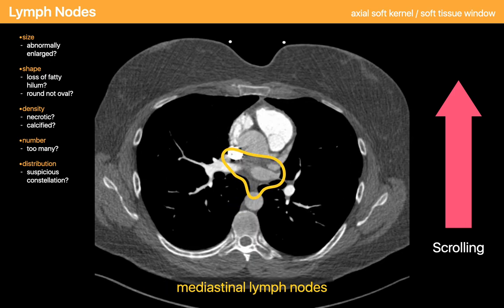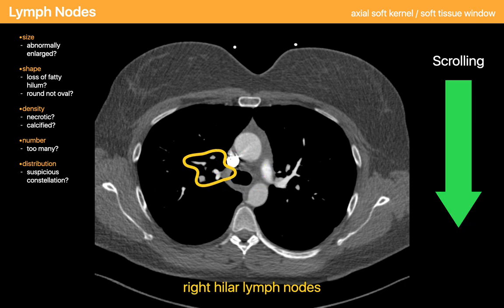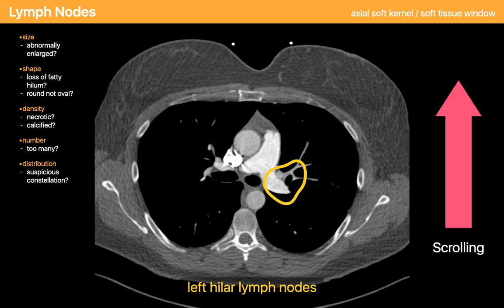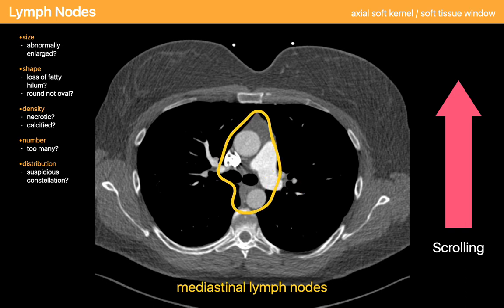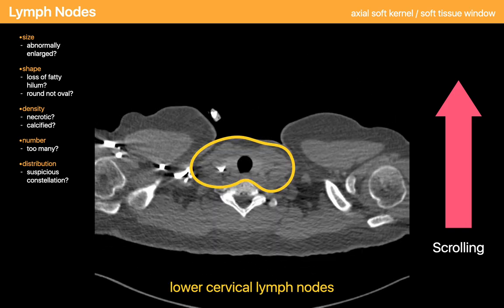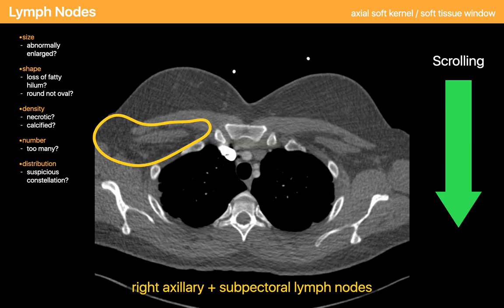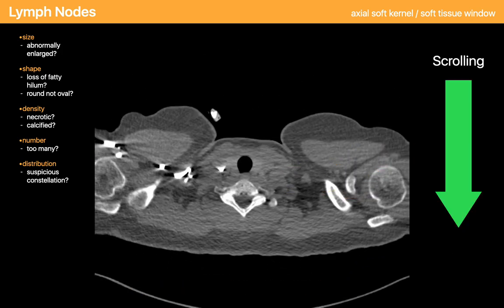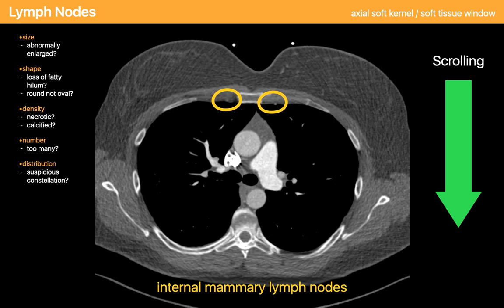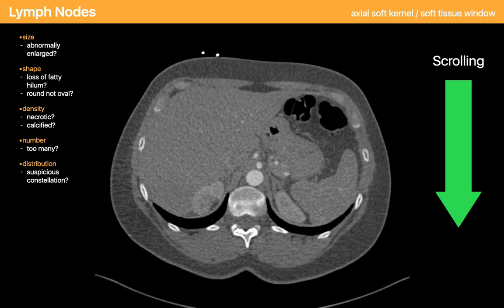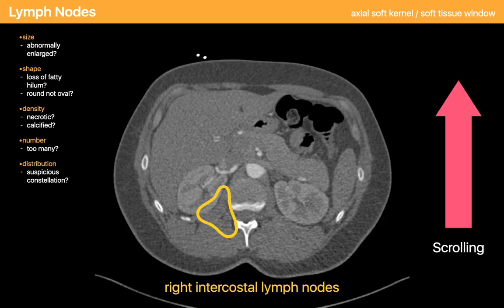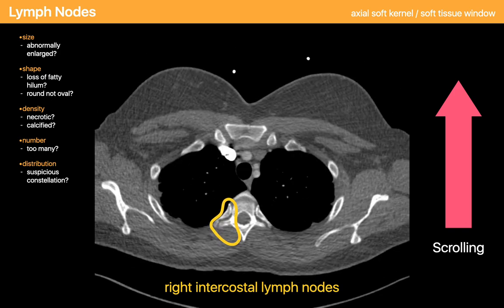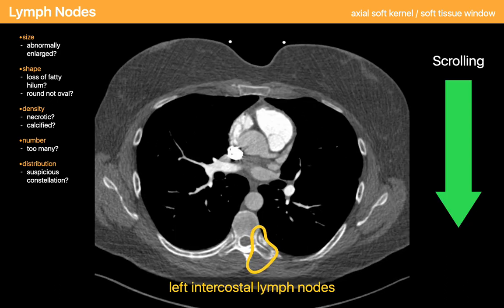I then check the paraesophageal lymph nodes, the subcarinal lymph nodes, the right hilar and peribronchial lymph nodes, the left hilar and left peribronchial lymph nodes, the mediastinal lymph nodes, low cervical lymph nodes, right axillary and right subpectoral lymph nodes, left axillary and left subpectoral lymph nodes, the internal mammary chain lymph nodes, and then the intercostal lymph nodes along the thoracic spine — one side at a time, starting on the right and then finishing on the left.